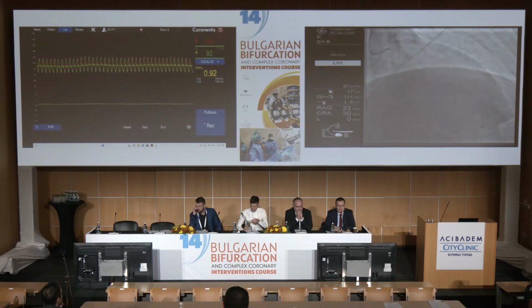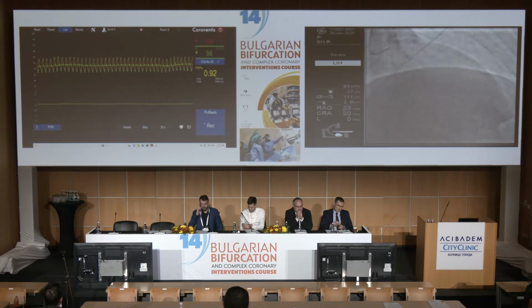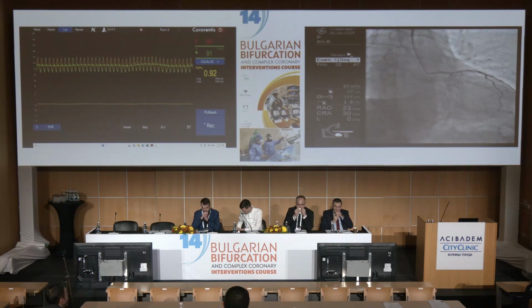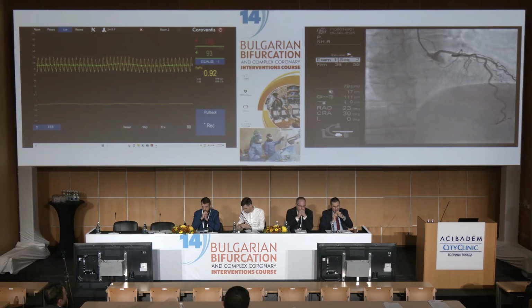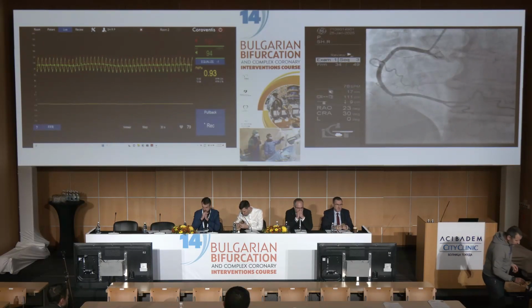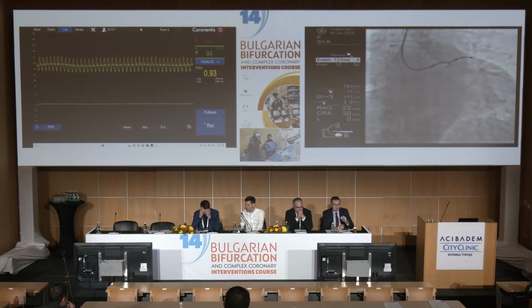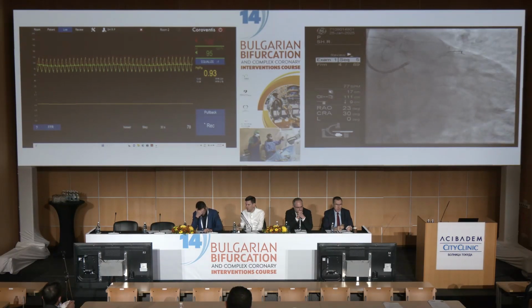So you're right, this is a young patient with chest pain, which is very suggestive of angina. There is indeed an ostial lesion in the LAD, but very, very moderate. It's barely visible. Maybe we can have a look at these shots again. So you see that the ostial lesion is a little bit pinched. Here in the cath lab, we also see very discrete calcification. So definitely there is atherosclerosis in this vessel. You see the small tapering of the ostial LAD, but the rest of the vessel is angiographically at least very, very smooth.